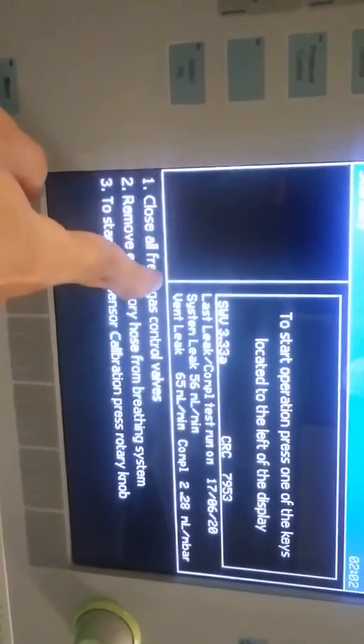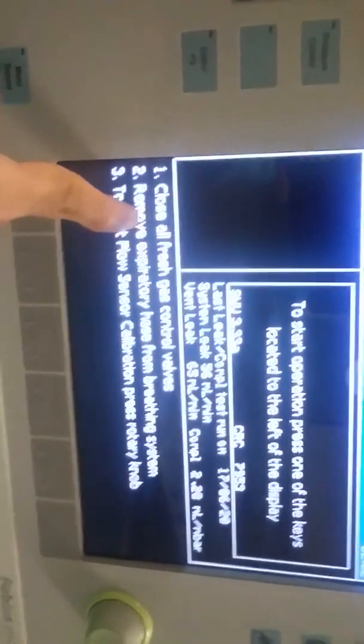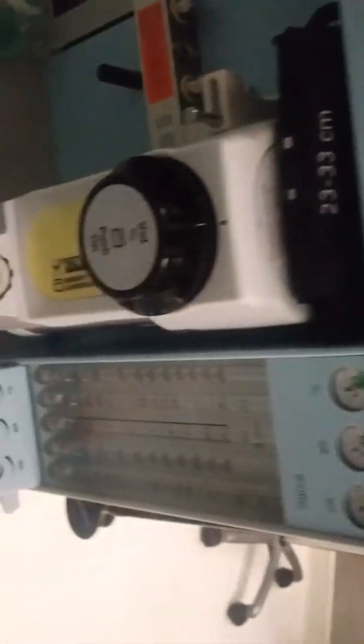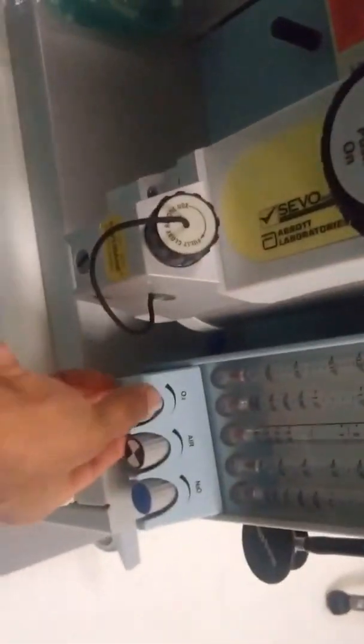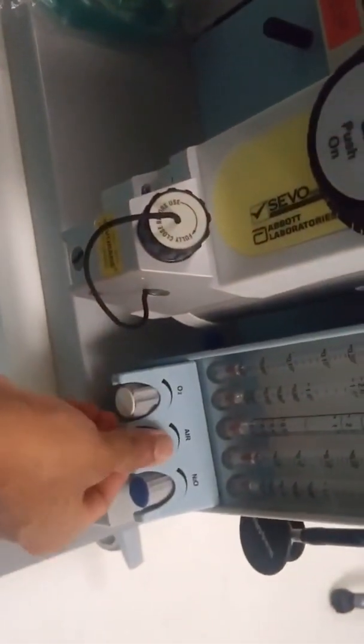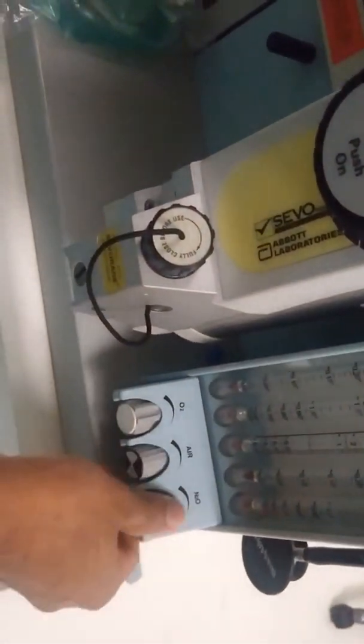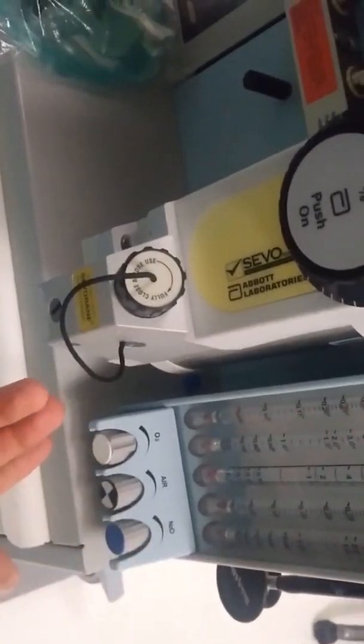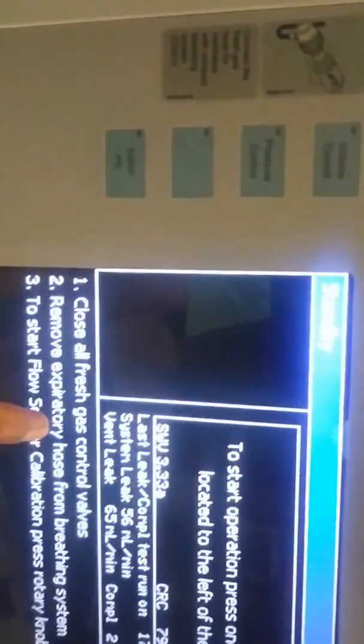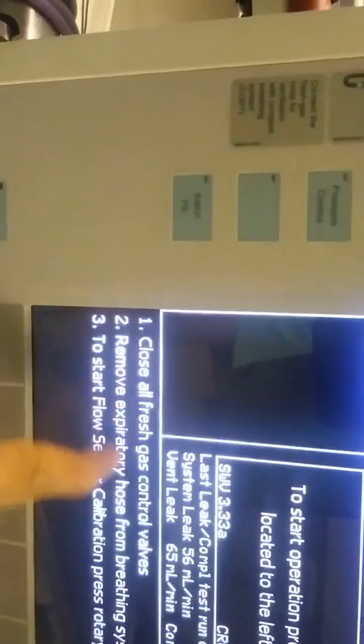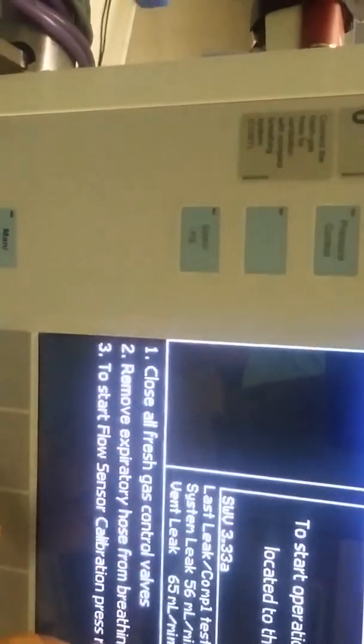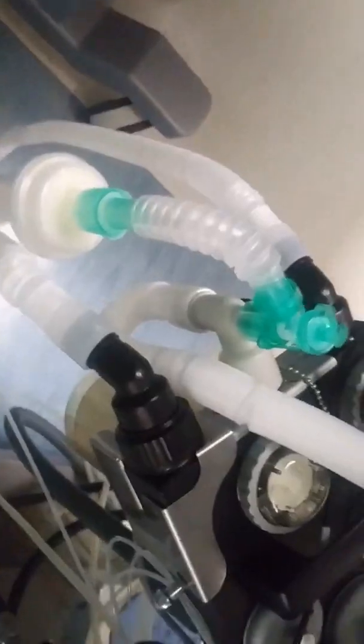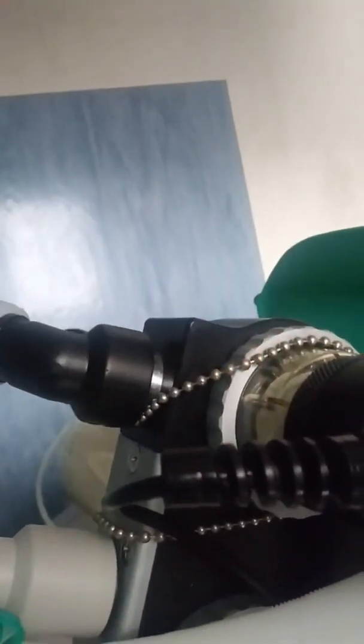Next we are going to calibrate flow sensor. When selecting the option we can see the mandatory steps. Close all fresh gas control valves. Second step is remove breathing circuit from expiratory limb. Confirm that all gas control valves like oxygen, nitrous oxide, air should be off. Identify the inspiratory limb and expiratory limb by the breathing system. Inspiratory limb is where the gas comes out from workstation to patient. Expiratory limb is where expiratory gases return back to workstation. The flow sensor is situated mainly in expiratory limb.